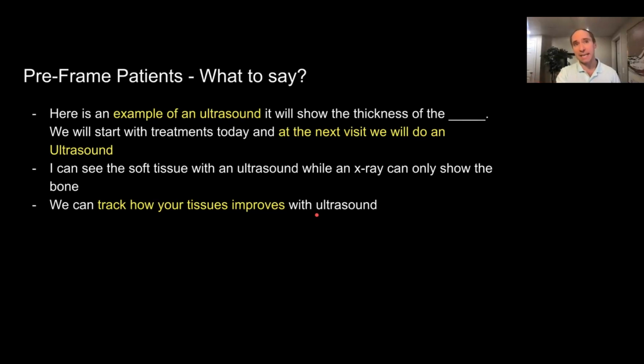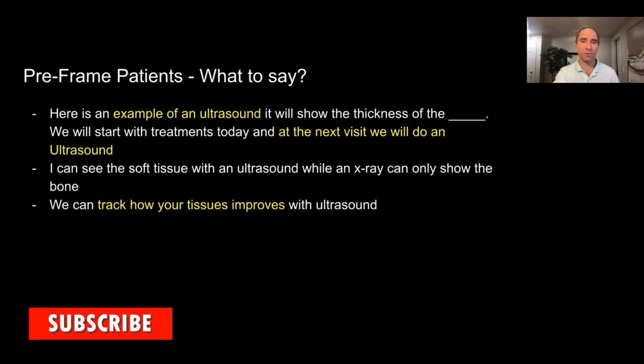And the other big thing, I know it's obvious, but I'm just going to tell you guys, is that I always do bilateral. Like for plantar fasciitis, let's say the right foot hurts. I can show them the right foot that's very thickened. There's an effusion in it, right? And then on the left foot, you can show them that it looks more normal. That is the biggest selling point for any type of treatment, is showing bilateral views.